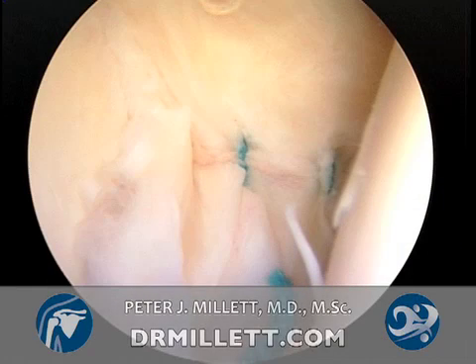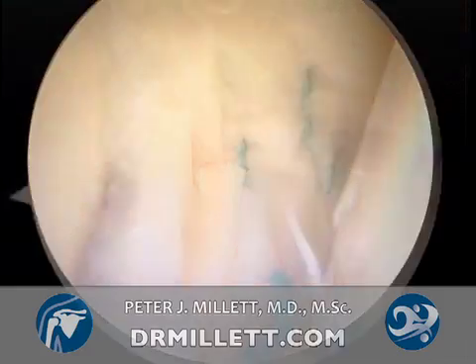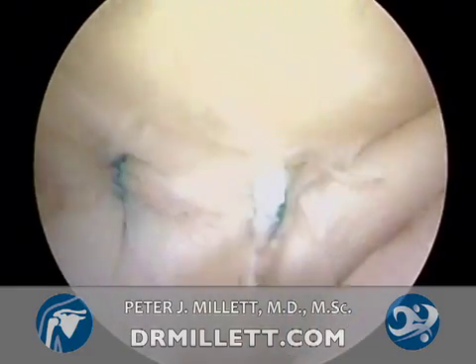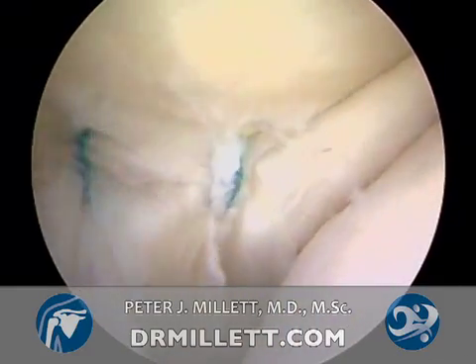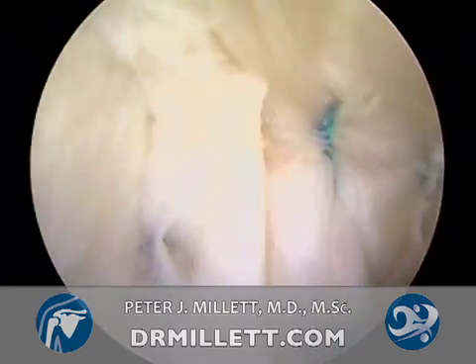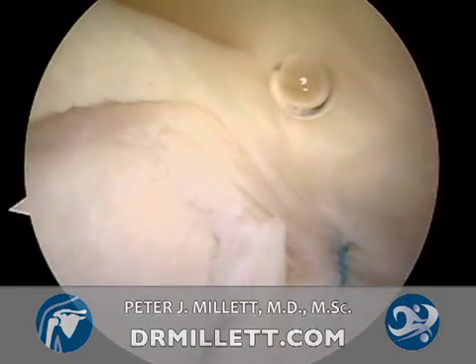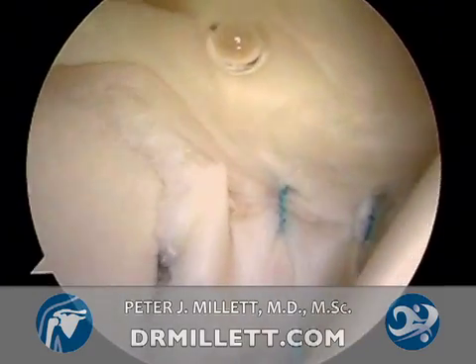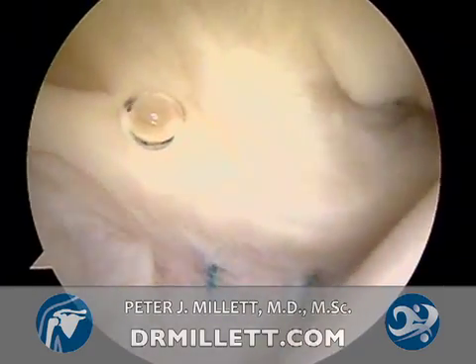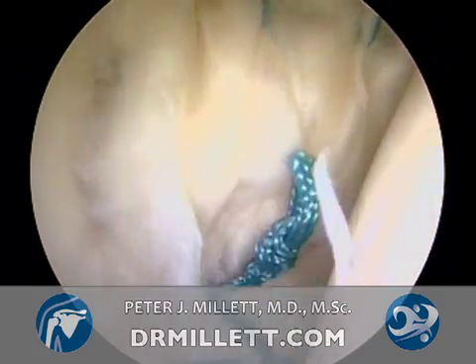Additionally, sutures are placed laterally as necessary to accomplish the desired closure magnitude. Typically two sutures are used, although in more severe cases three can be placed. The final rotator interval closure is seen here in addition to the completed anterior capsulorrhaphy.